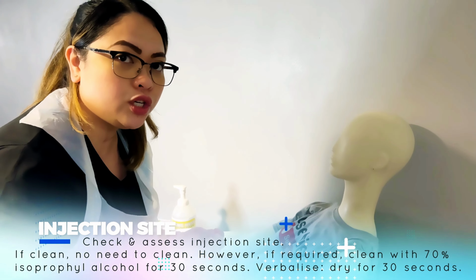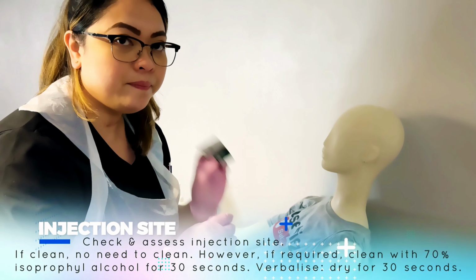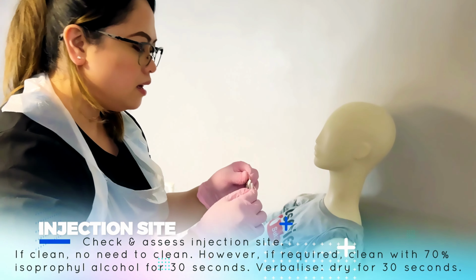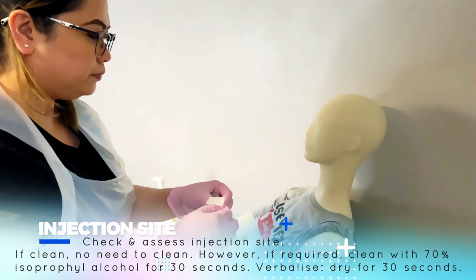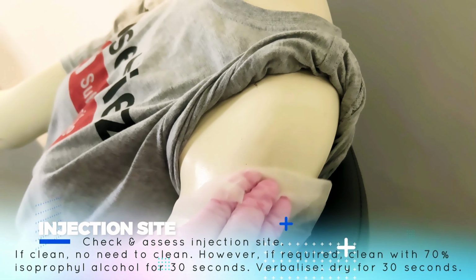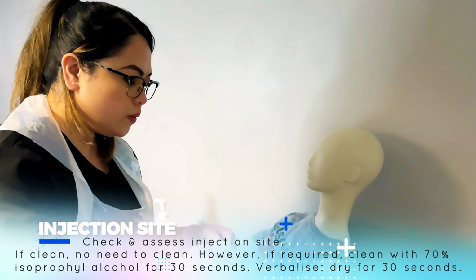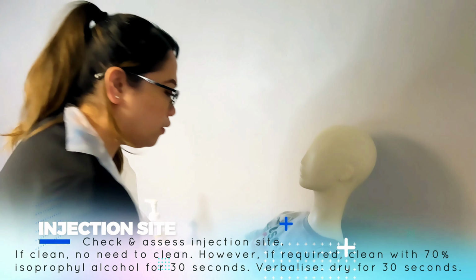I just need to show it to you in this procedure, okay? I'm gonna clean the injection site with chlorhexidine, 70% alcohol. So, again, get the swab. Clean it with a single stroke from top to bottom. Or, you can do it from the center, from inner to outer.